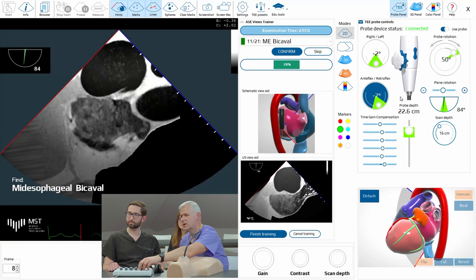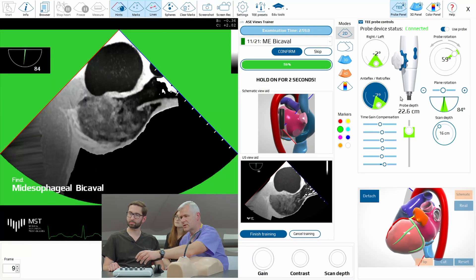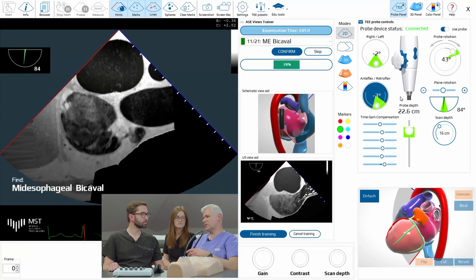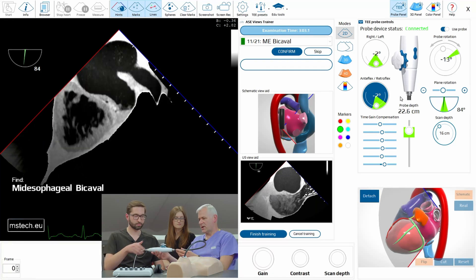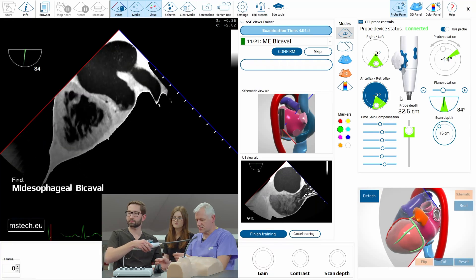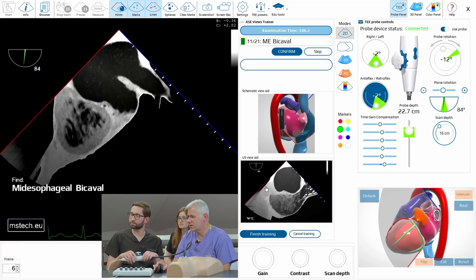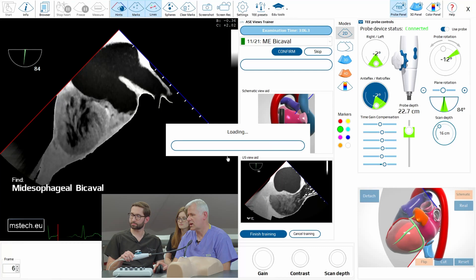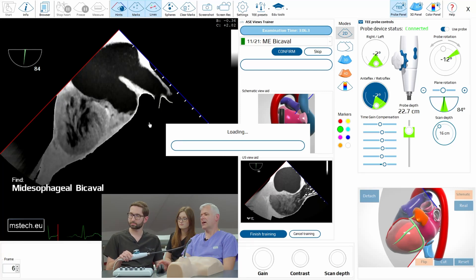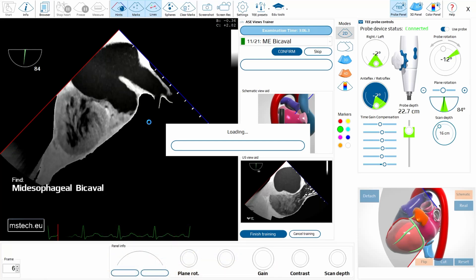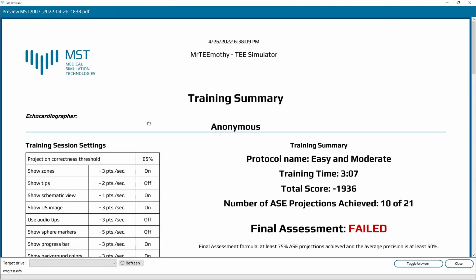After about five minutes I did all the important views for this training. You can practice yourself, and when you finish you can also take a test. The machine is creating a report — of course I failed because I stopped in the middle of the protocol.